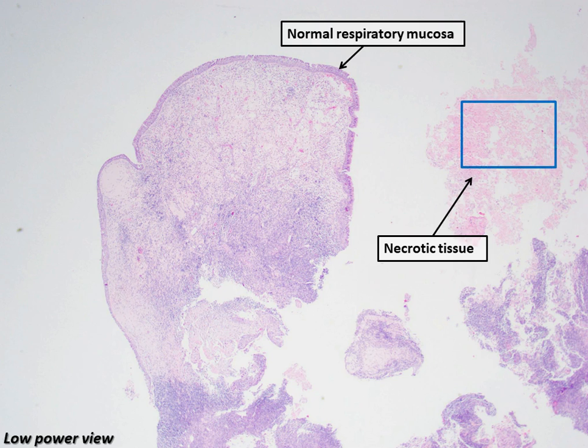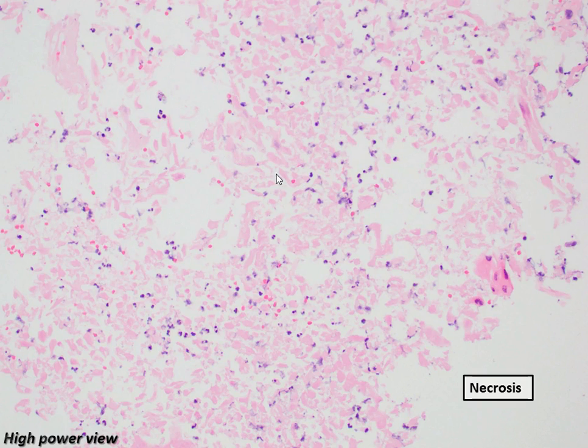Zooming into the necrotic tissue fragments, we see many pinkish ghost outlines of cells without their nuclei. Here are some mixed inflammatory cells.